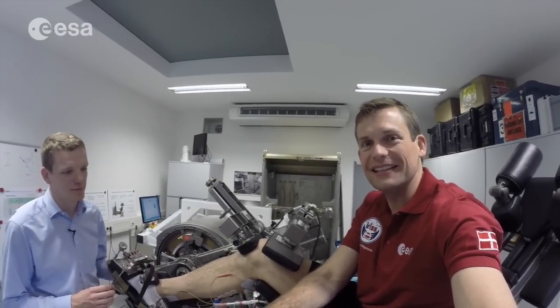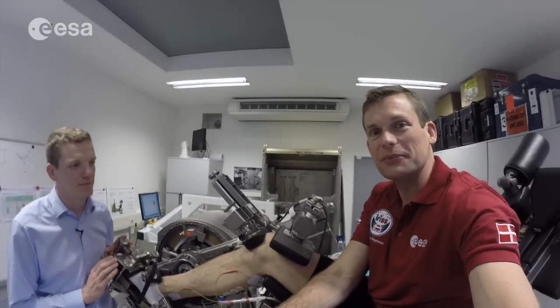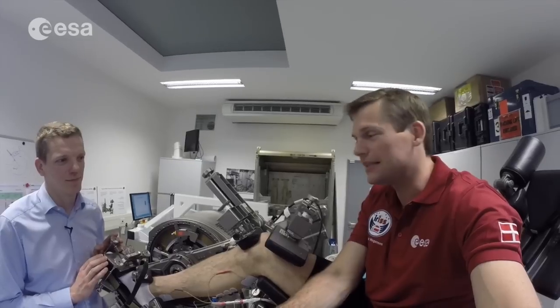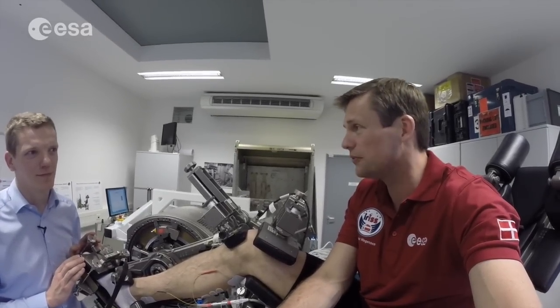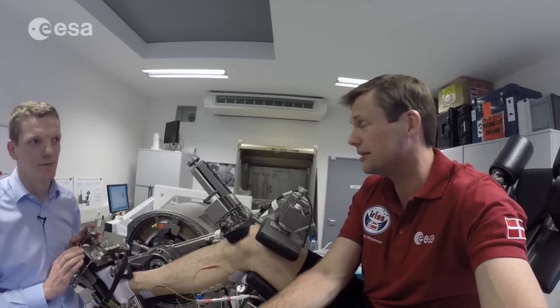All right, I'm back at EAC, this time with Olivier. I'm sitting in MARES, which is the Muscle Atrophy Research and Exercise System. It's actually going to be one of the biggest activities during my mission on board the space station. This is an important piece of European hardware, which we'll be using in the future to do research on muscle atrophy on the astronauts.